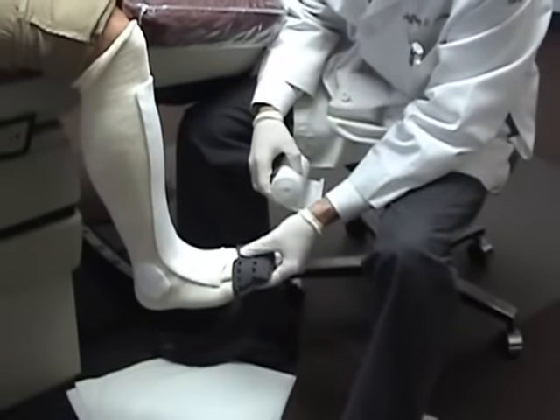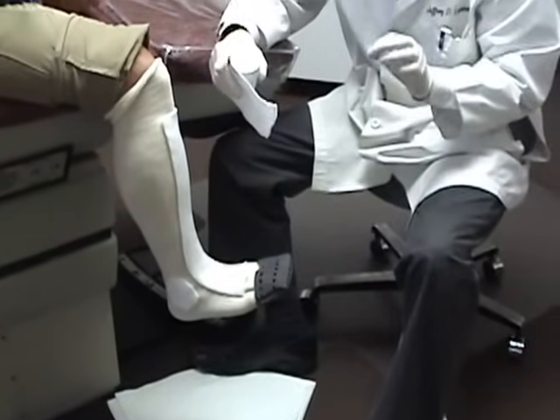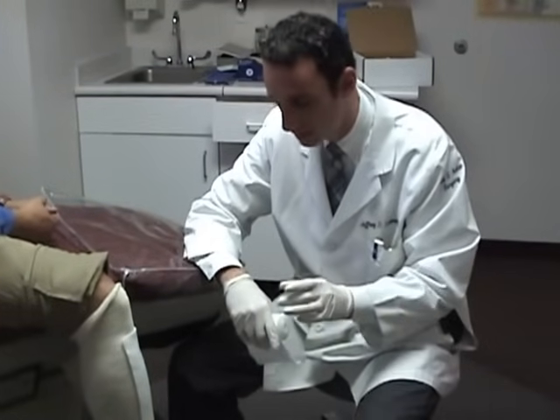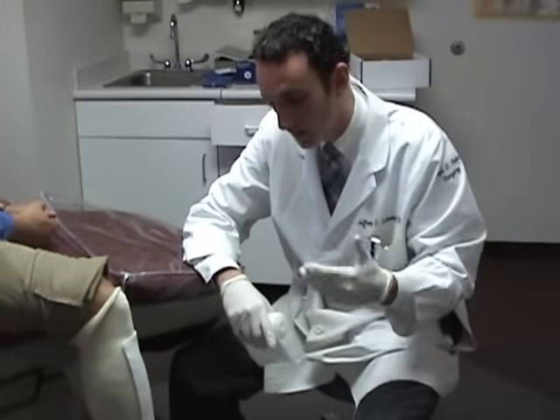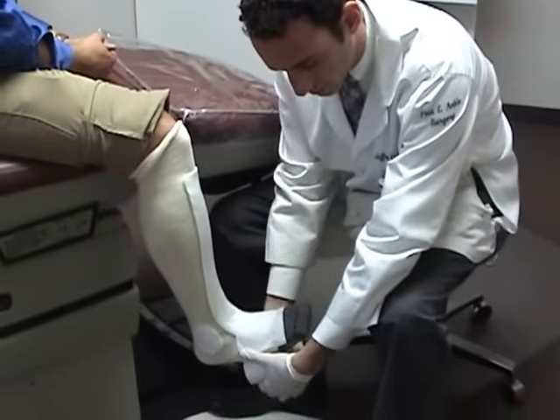The next step is padding for underneath. We already have plenty of padding at the toes so we do not need any extra padding there. We want enough padding to protect the skin, but not so much that we lose our concept of total contact. If there is too much padding and the cast is not in close enough contact with the skin, it will not be a true total contact cast. What I have found works best is to try to keep it to roughly one layer of padding.